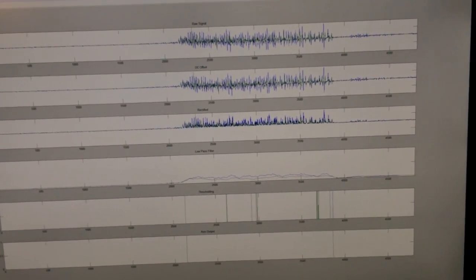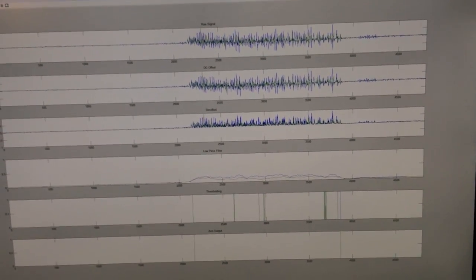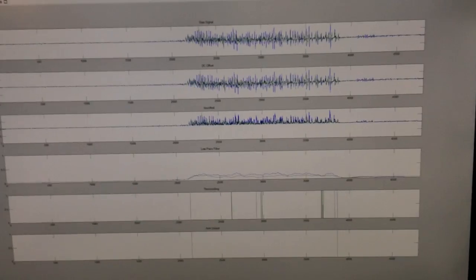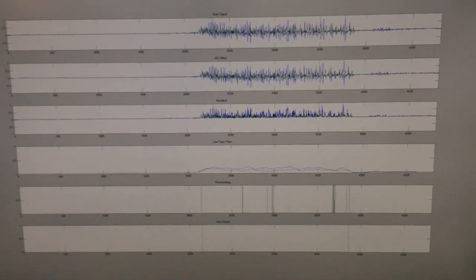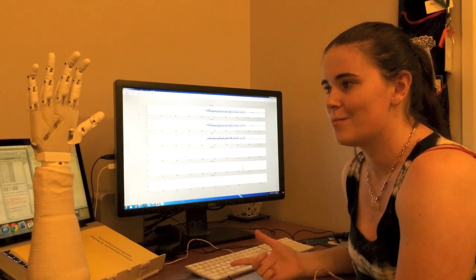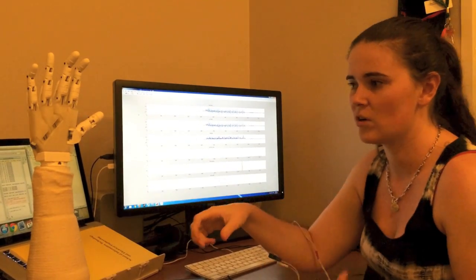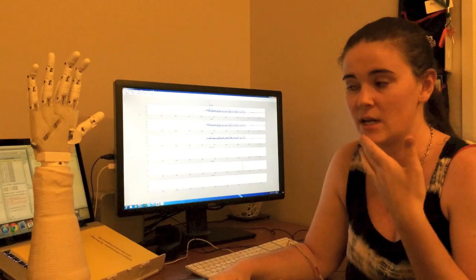So that's really important, knowing how long the person has activated their muscles, so that the action the arm produces is proportionally similar to what the muscle said it should be. Okay, so that's one motion based on one action that I produce with my muscles. That's not very useful for someone with a prosthetic arm.